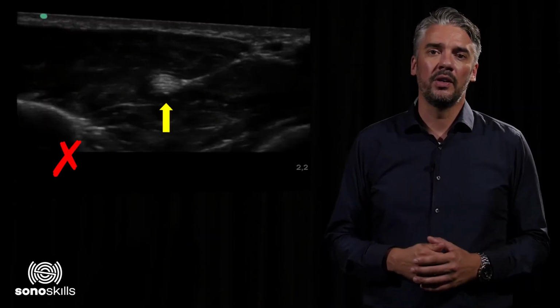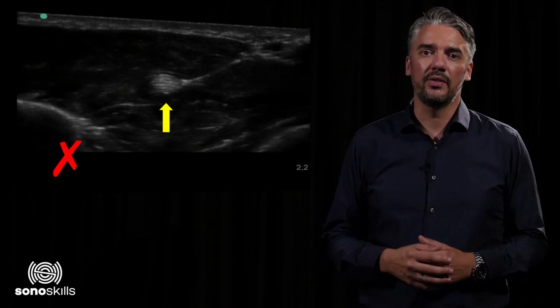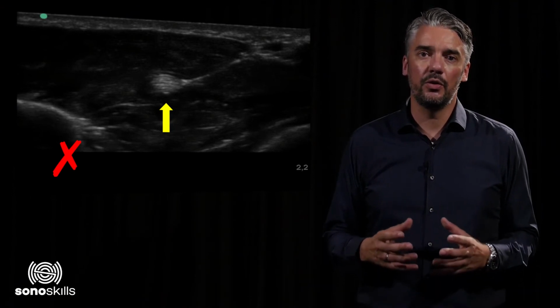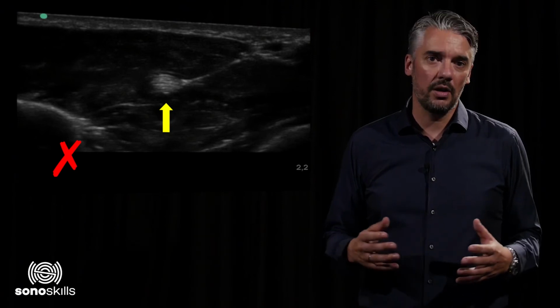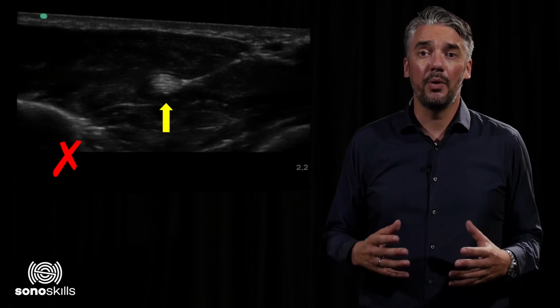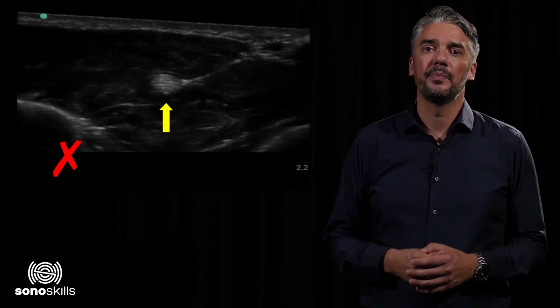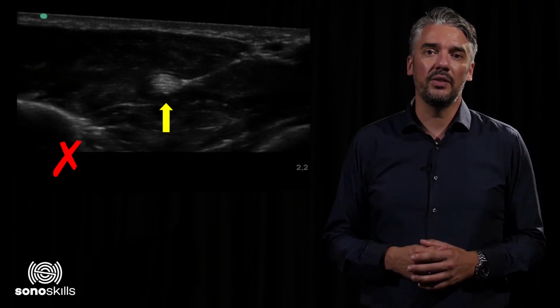This is the opposite. The level of gain has been decreased to almost 0%. Due to a smaller gain, the entire image turns dark. This results in loss of intramuscular architecture. Also, it obscures all hypoechoic details because everything turns dark as well. Improper gain levels result in less visibility of intrastructure architecture.